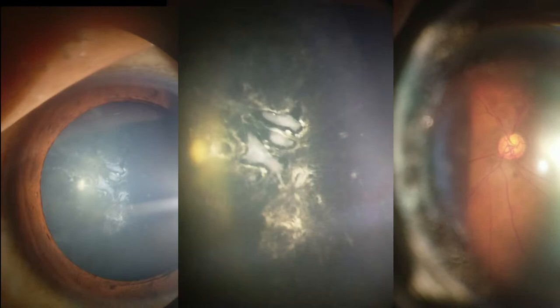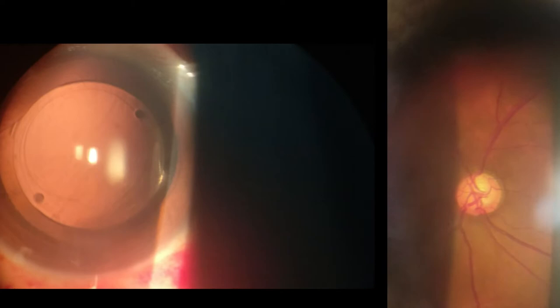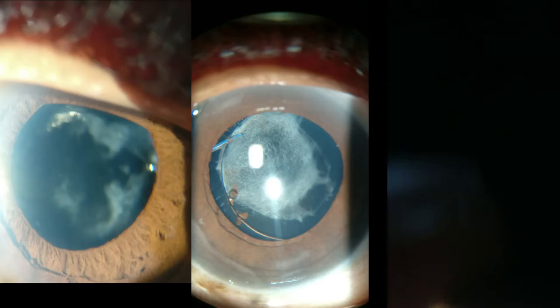On the left you see a Descemet scroll on the cornea. On the right you see the fundus. On the left you see the slit view of the cataract; on the right is the fundus. On the left you see a PCIOL inside a capsular bag. You can see a cauterized conjunctiva with sutures visible under the conjunctiva.